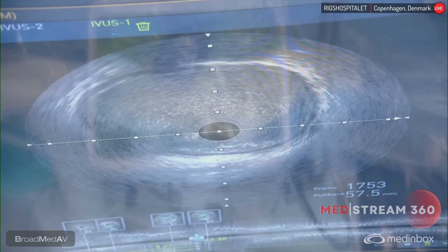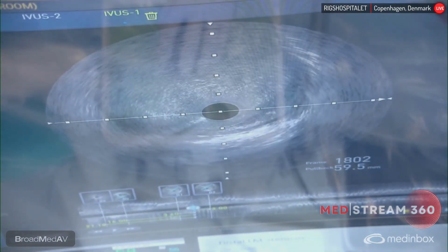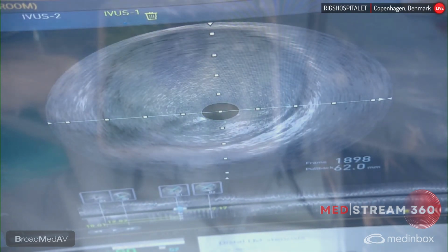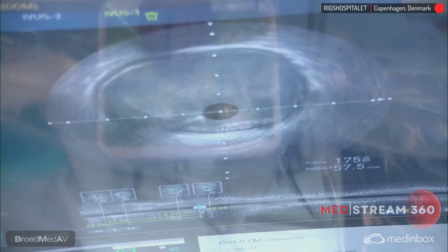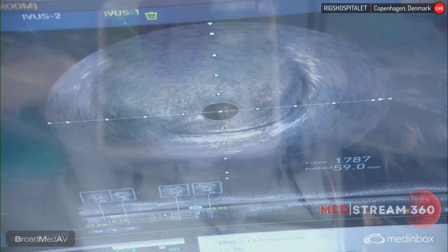So if you go with a 24, you don't need to land it distal to that one. So maybe it's better to land it. Yeah, I think that as well, because the vessel is narrower there, of course. So the 4.0, 24, there's the diagonal coming in there at the top at 12 o'clock. So you need to be above that one.